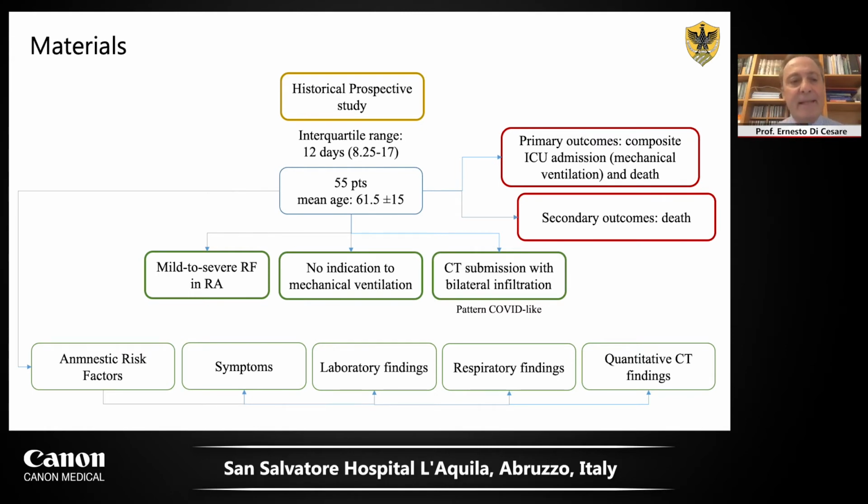We collected anamnestic risk factors, symptoms, laboratory findings, respiratory findings, and quantitative CT findings. The primary outcome was admission outcome and death. The secondary outcome was only death.